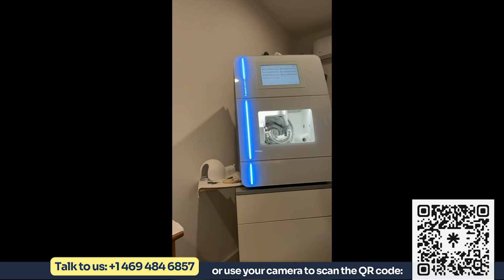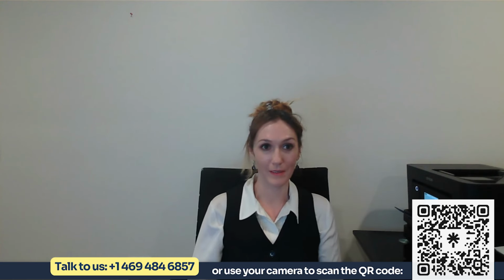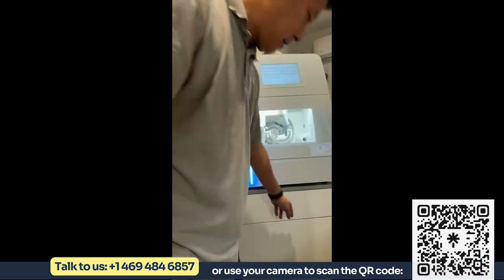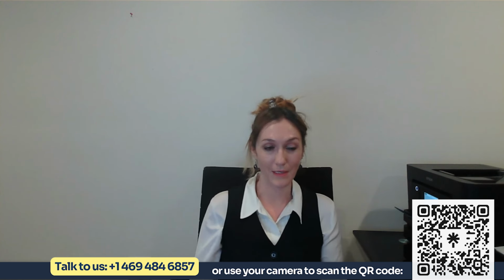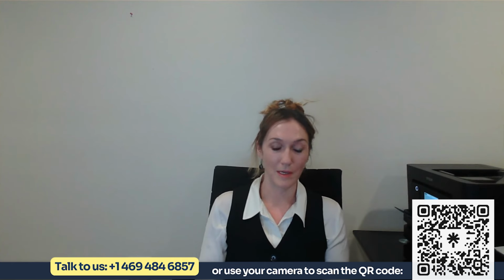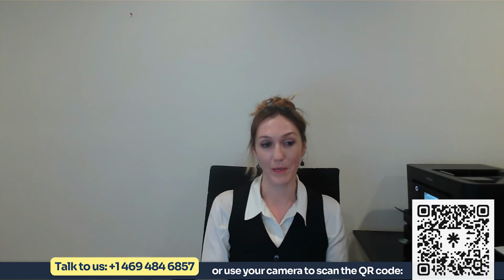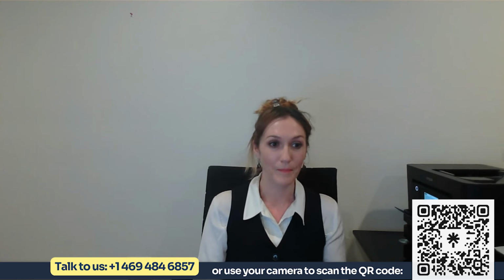And if I can make a comment on the suction that you showed really quickly, you have the PowerCam EC in there? Correct. Okay. Yeah, that is a brushless motor, which is important when you are running these suctions day in and day out. You don't have to worry about pulling it out of service, changing the brushes on the motor, or changing the motor, which can be time intensive depending on what suction you have with the mill.